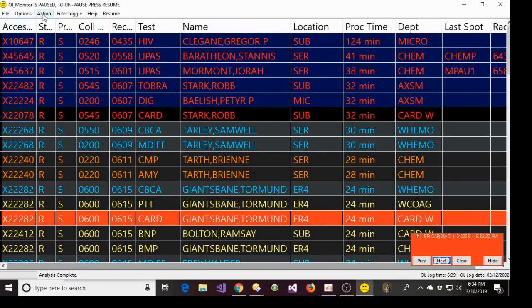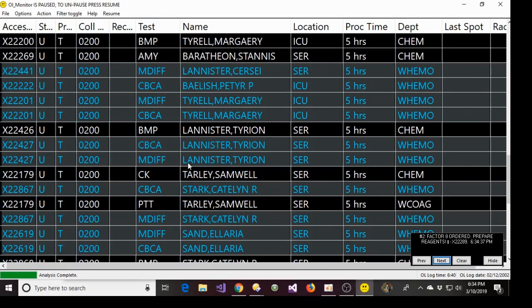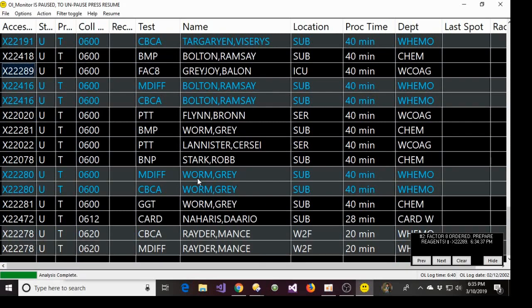Let's see if that works. There we go. So as soon as they order factor 8, this hasn't even been received yet. It's somewhere down here on the list. Where is it at? Ah, here it is. They ordered a factor 8. It hasn't been collected for 40 minutes, but whatever. We're going to be ready for it because we got a warning. Otherwise, you might not have seen it down in this list.